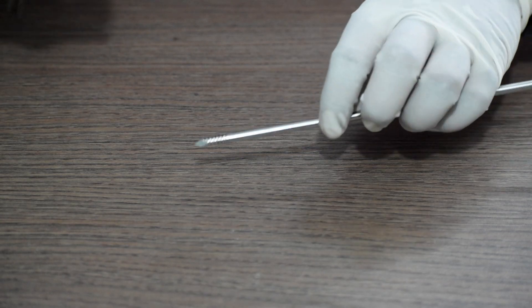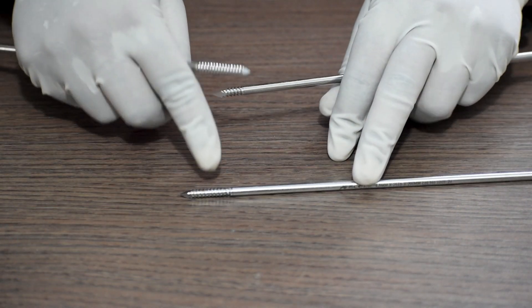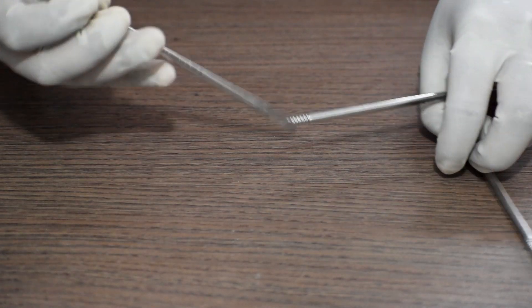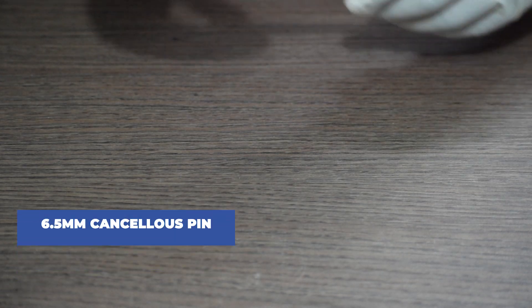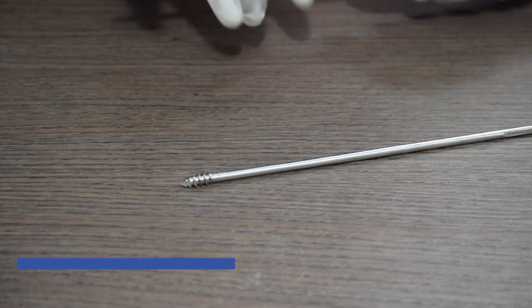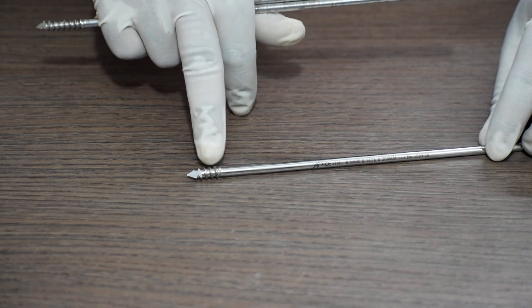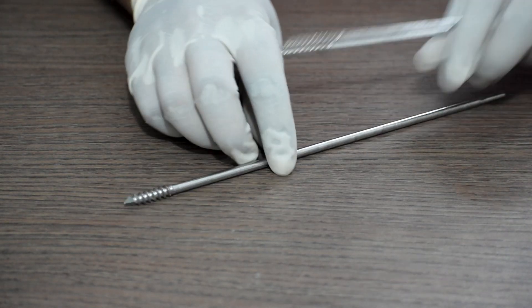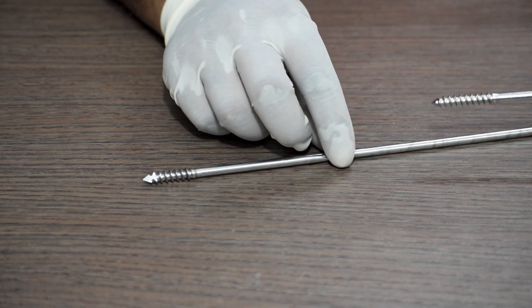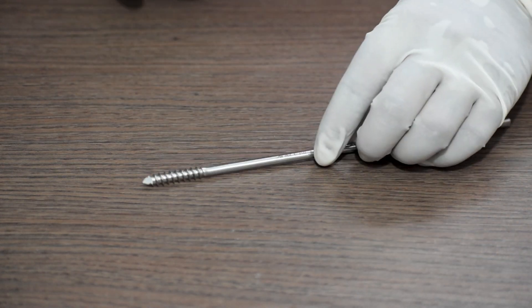Next, this is a 4.5mm Schanz pin, 16 thread. Next, this is a 6.5mm Schanz pin, 32 thread.